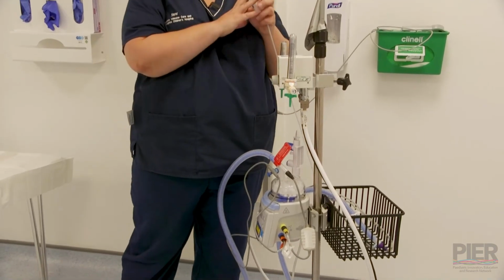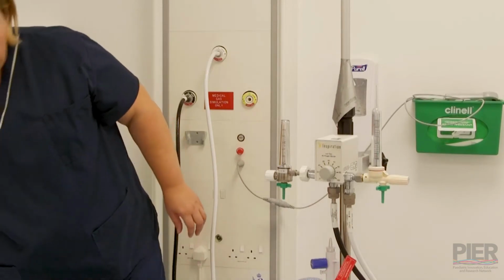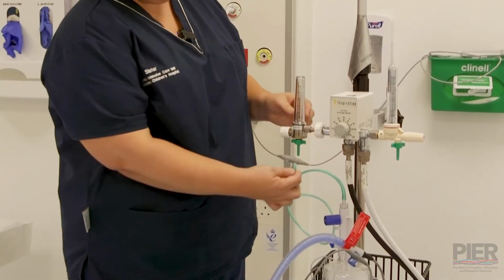When we're ready to go, we would then attach the water onto the humidification chamber. Take green oxygen tubing from the flow limiter to your flow meter.